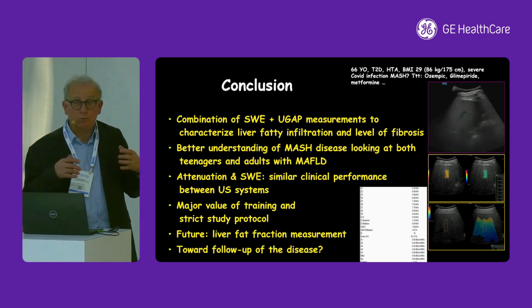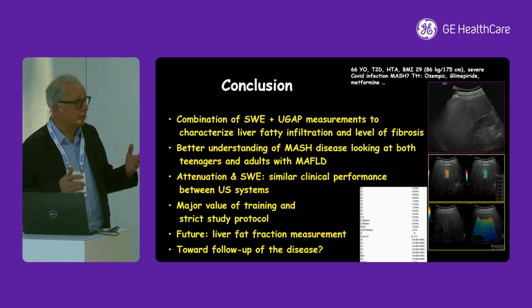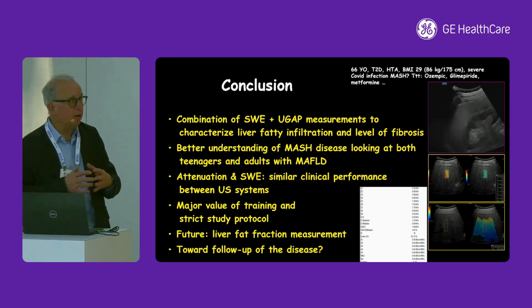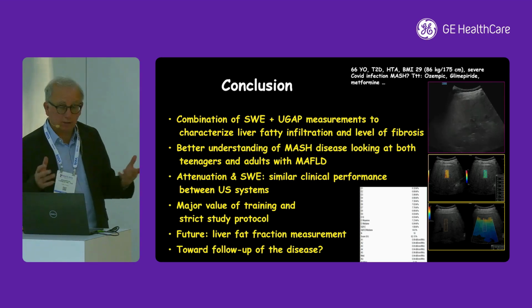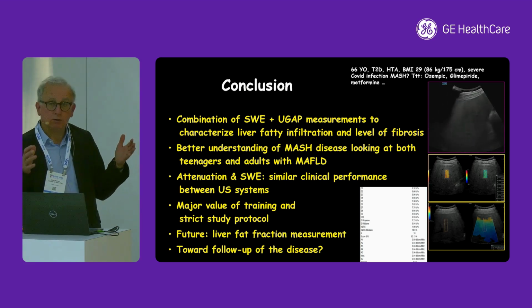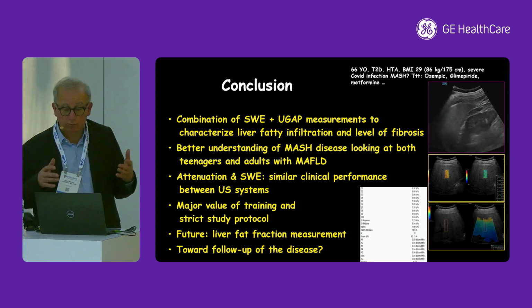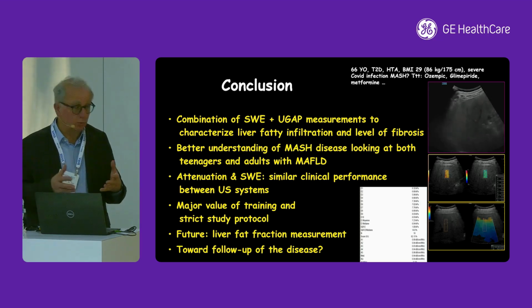And this is something we are looking at, the follow-up of patients with these ultrasound tools, because they are much better accepted than the MR measurements. And this is true in both teenagers and adults. Attenuation and shear wave should be done together, and they have a similar clinical performance between the ultrasound systems, meaning that we are able to follow the patient and diagnose the patient.